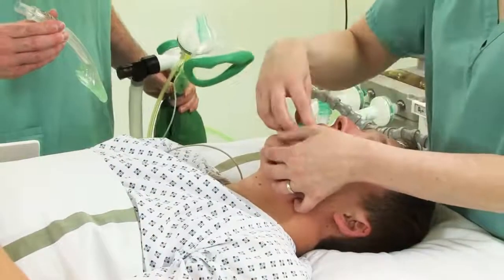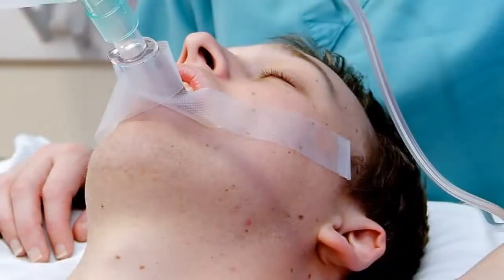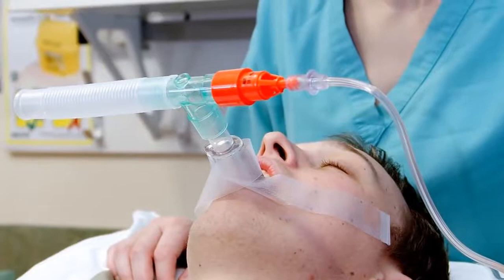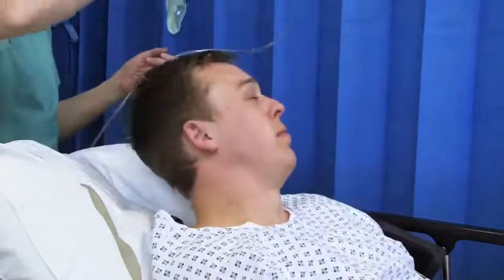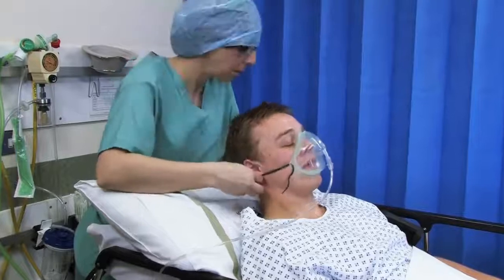The device should now be inserted according to the manufacturer's instructions for use and taped down maxilla to maxilla. Once the patient is taken into recovery, the patient's airway will need to be maintained and oxygen administered via a T-piece. The device, iGel or laryngeal mask, will need to be removed and oxygen delivered via an MC mask.